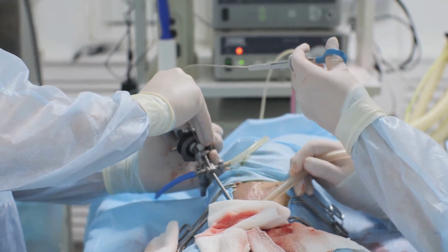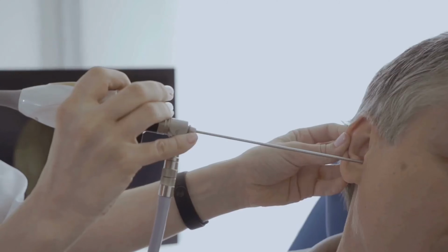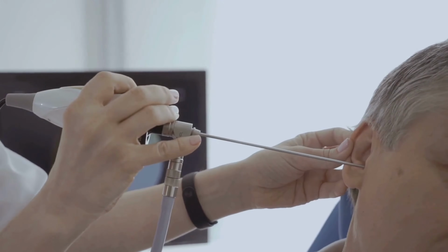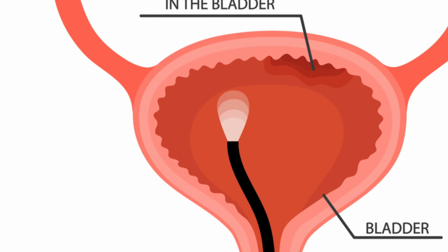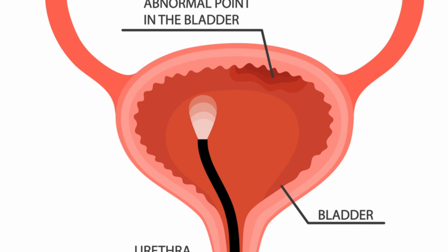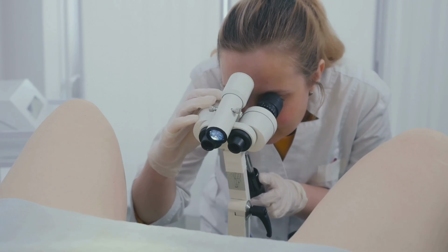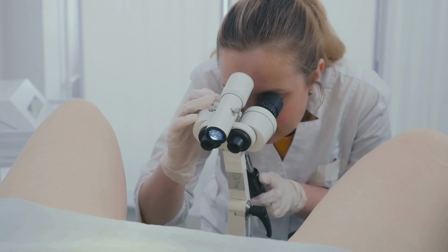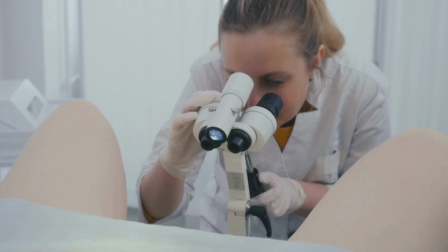Cystoscopy is a medical procedure that allows healthcare professionals to examine the inside of a patient's bladder. It is usually carried out by a urologist in specialized settings. It is useful for diagnosing the causes of certain symptoms and for treating various bladder conditions. It is a common procedure that a healthcare professional must know, as many patients may want to know if they have any condition requiring cystoscopy.